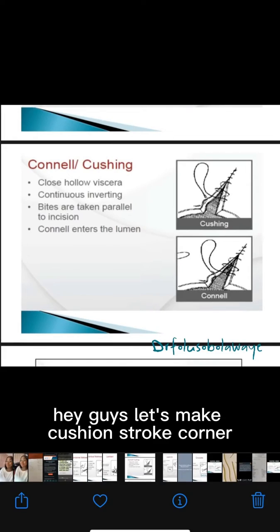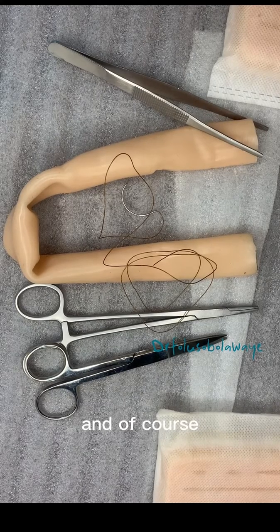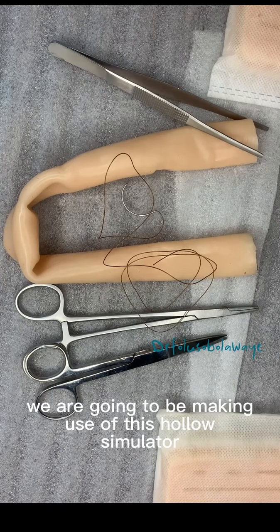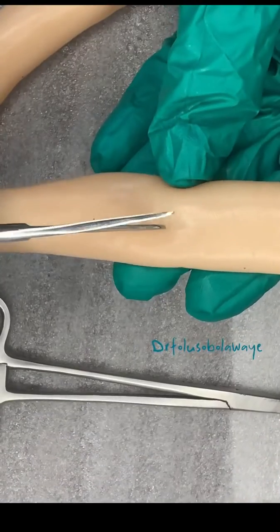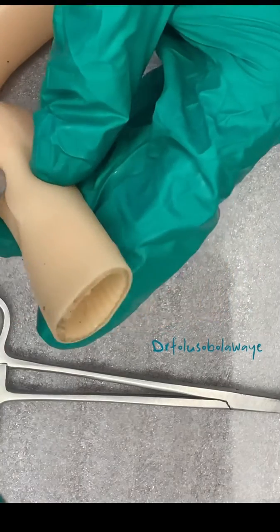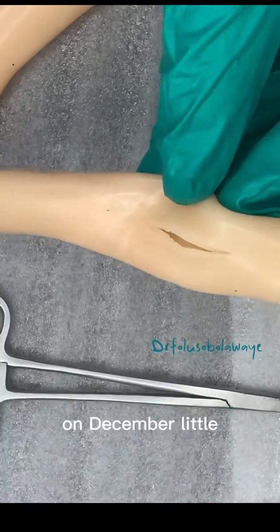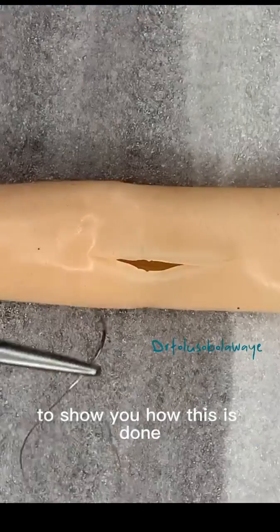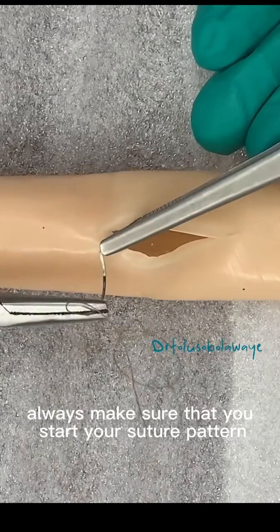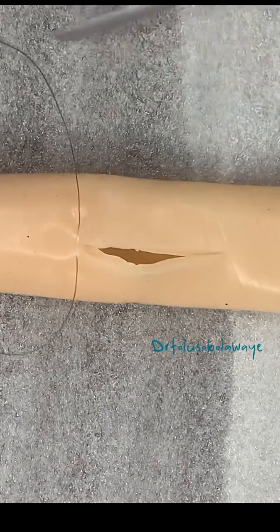Hey guys, let's make the Cushing-Connell suture pattern, and of course we are going to be making use of this holo simulator. I'm trying to make a little bit of incision and extending it with my scissors on this simulator to show you how this is done. Always make sure that you start your suture pattern from the apex of the wound.